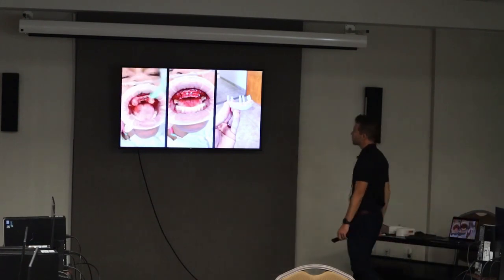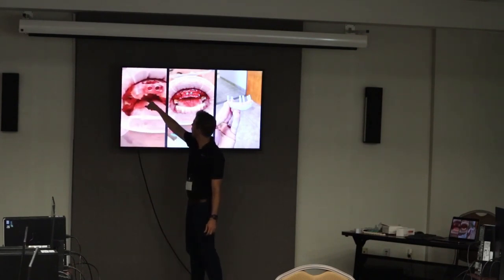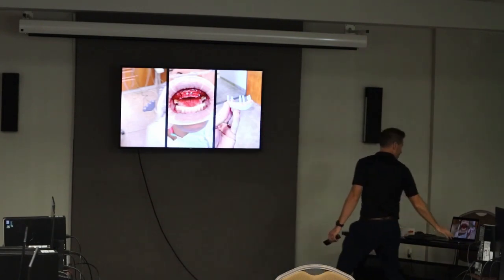Here's the guide on — you can see it's resting on four teeth, back here on the second molars. I didn't even trim off all the nubs; just print and go. And here are the multi-unit abutments placed in.